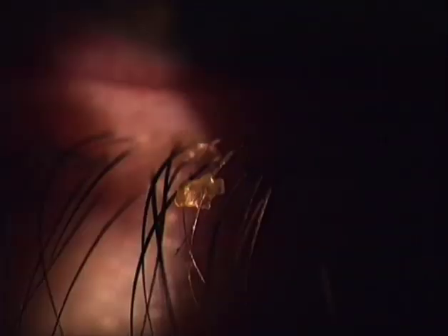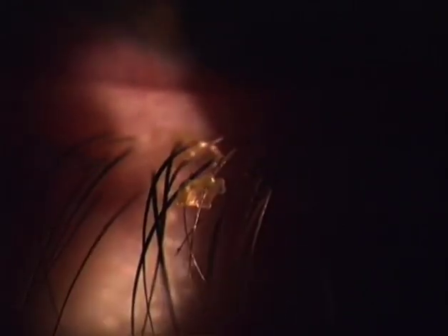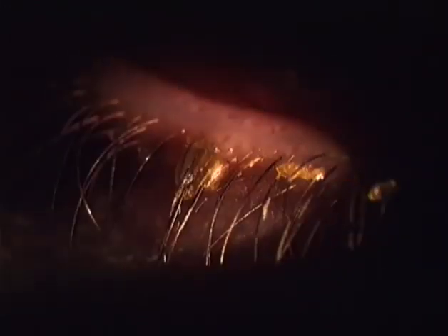When drying, secretions of semi-fluid material surrounding the shaft of a single cilium may form scales that are homogeneous in structure and thus semi-transparent, and when engulfing several cilia, they form accumulations with even and reflecting surfaces.